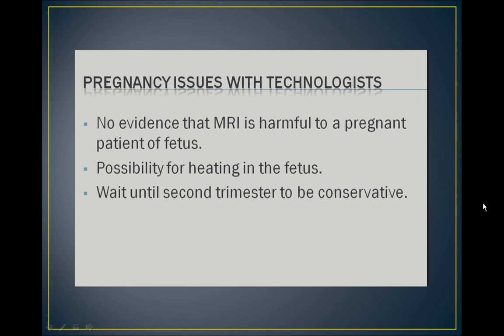Even though there are no known biological effects, some pregnant technologists decide to err on the side of caution and they choose not to enter the MRI suite until at least second trimester. In addition to being conservative, technologists should also not remain in the scanning room during a scan. This is when the gradients and the RF energy are being applied. This is simply because we don't know of any long-term side effects.